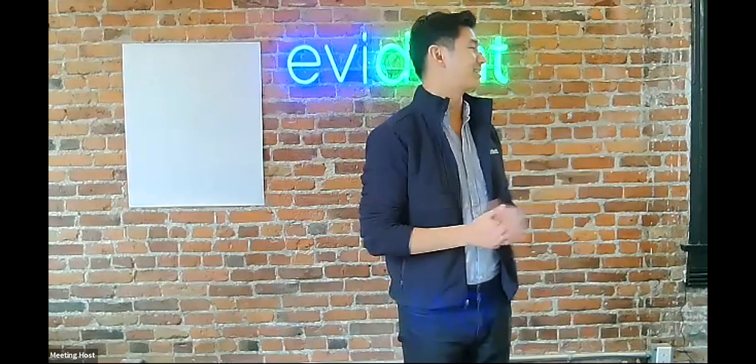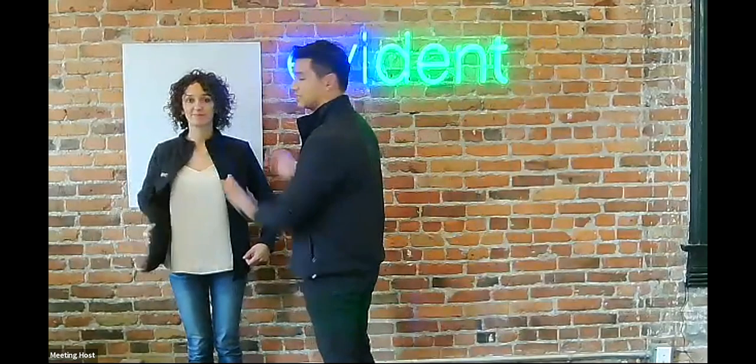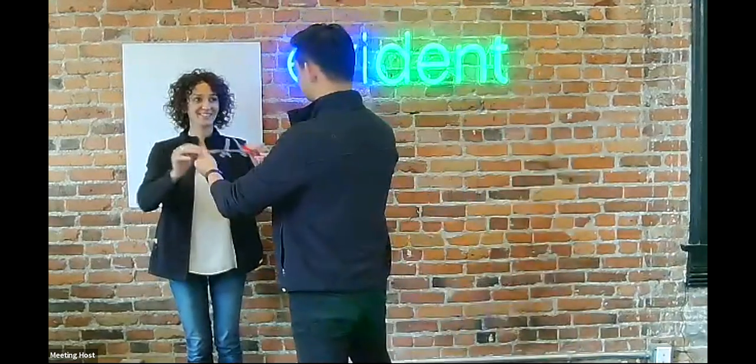So I'm going to invite my colleague Sophie, and she's going to be our patient today. Get your patient to either stand or sit in front of the white backdrop and center them. Then the next thing you want to do is take the facial reference glasses, and the patient's going to put them on.